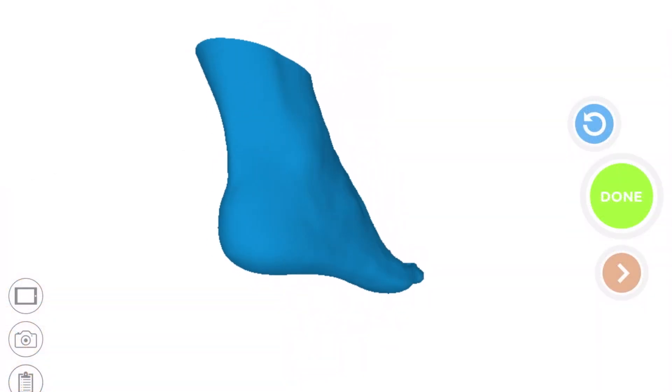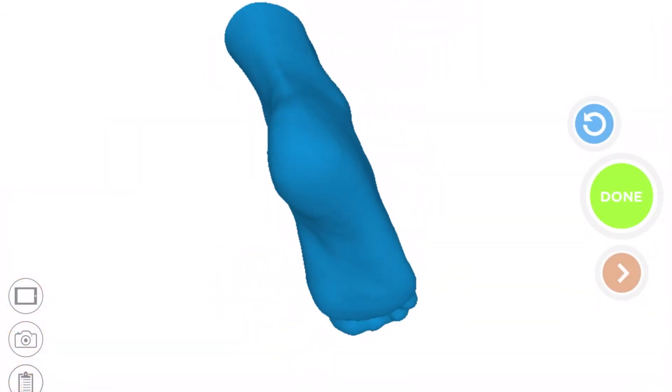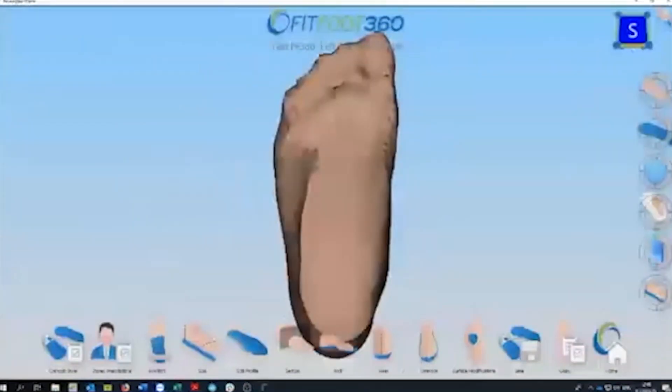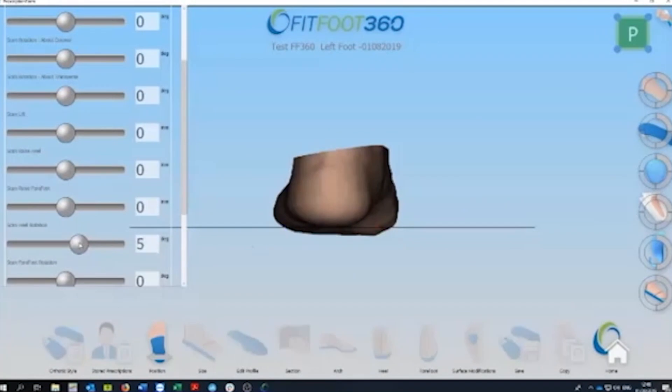whole device thicker. Having taken a 3D scan of your foot, we write a prescription for the features that we want to include, which gets sent along with your scan to our lab within a secure portal.